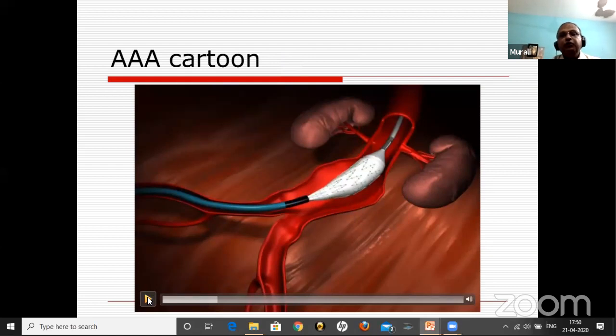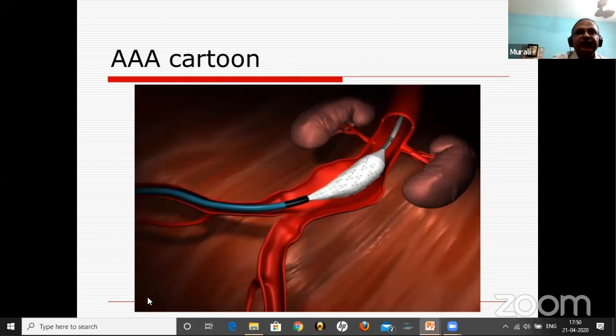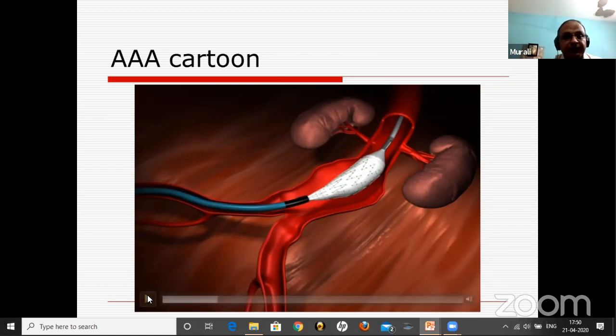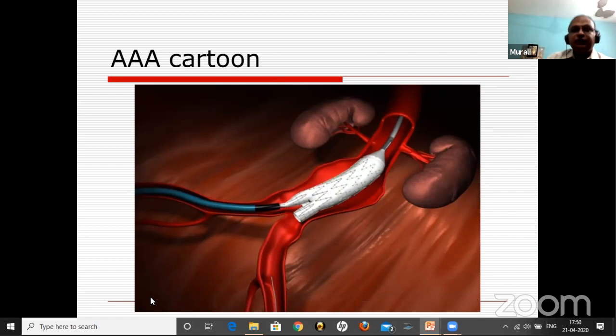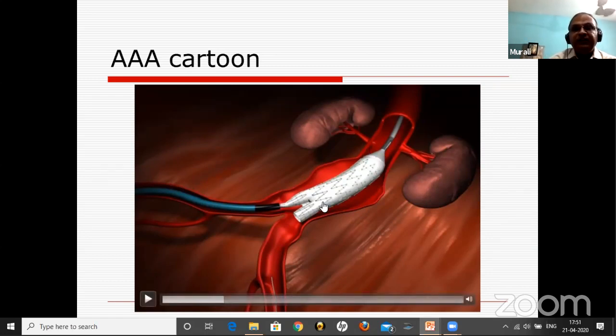So now you have opened 2 or 3 stents. The next thing is the opposite gate will have to open. So, yeah. So you can see here, this gate has opened. Okay, now the next step, what you want to do is, you can release the top cap straight away, now at this position. Or if you're confident, you can cross it and then release the top cap.